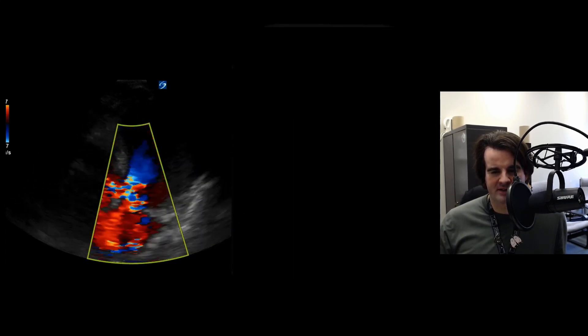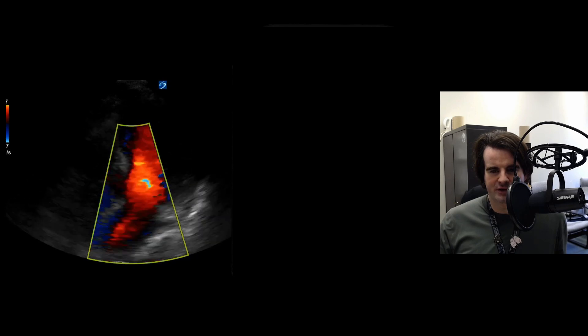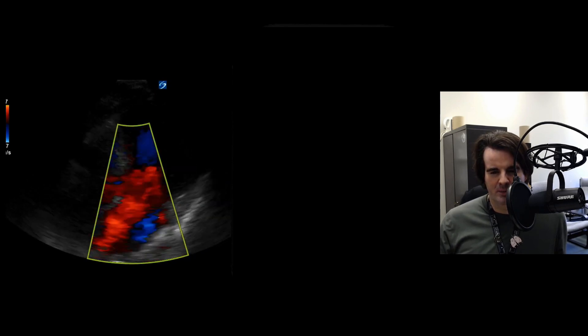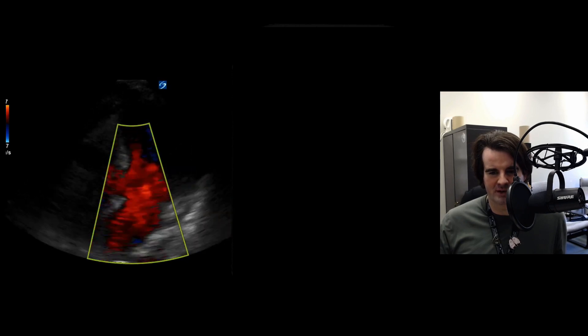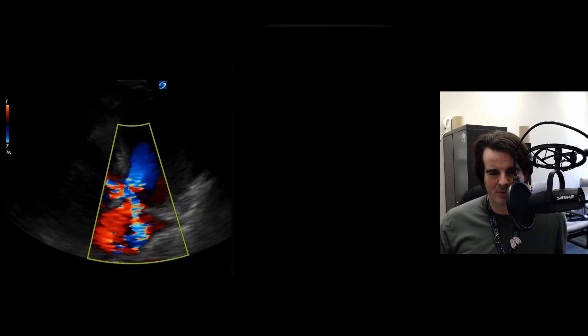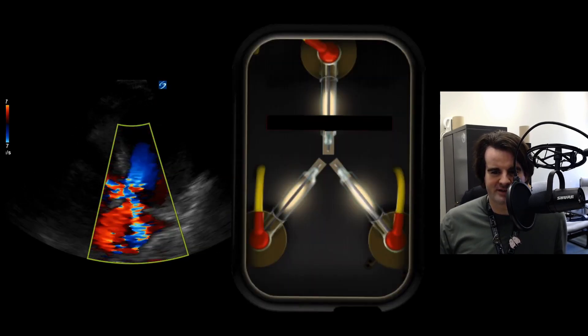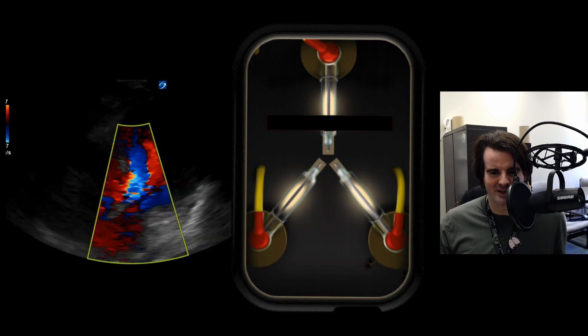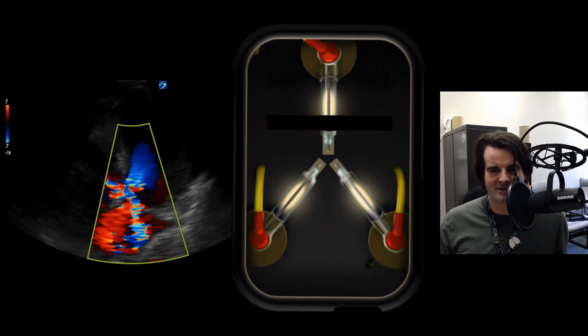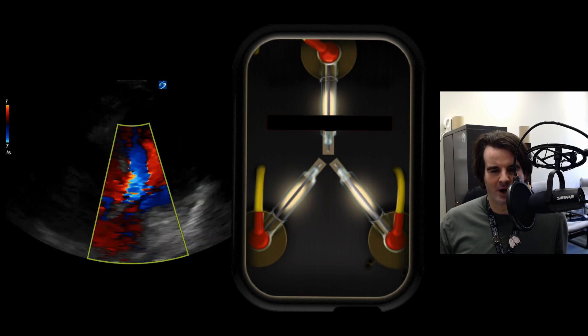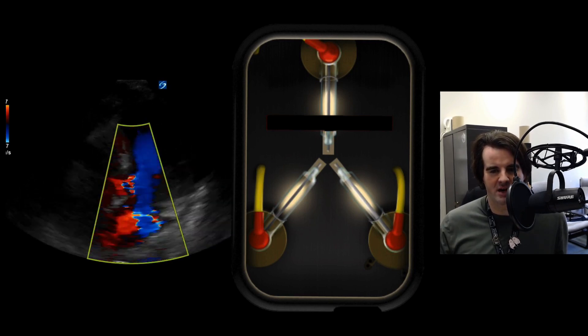When we add color Doppler, we see a very distinct profile: flow acceleration to the outflow tract, but also an eccentric MR jet directed posterior-laterally. When I've discussed this with colleagues, we came up with the idea of a 'reverse flux capacitor' — like the flux capacitor from Back to the Future, but flipped around, giving this upside-down Y appearance of what we see here.